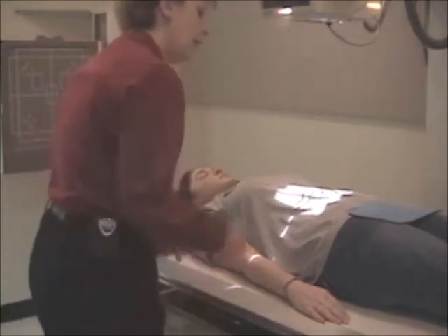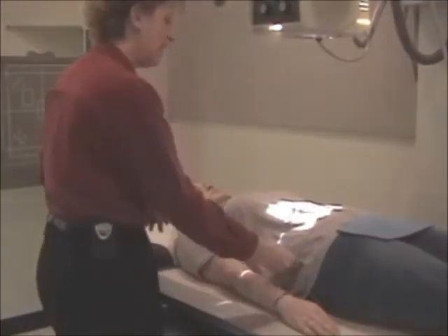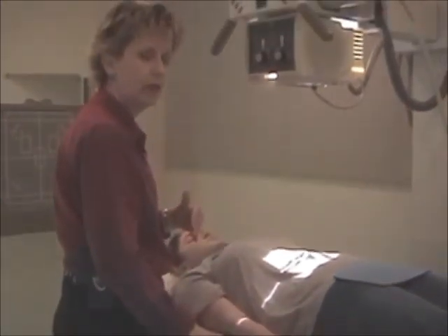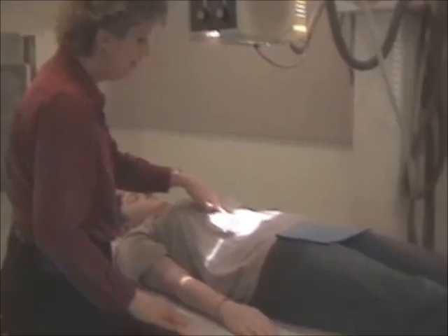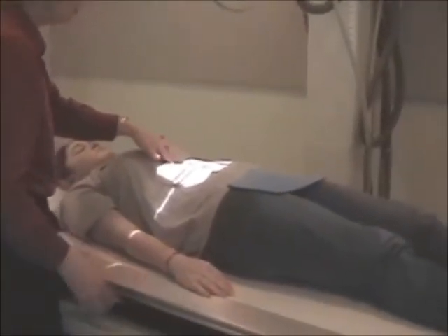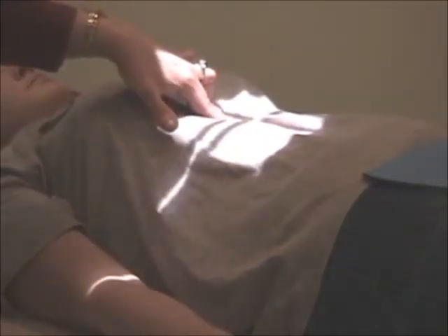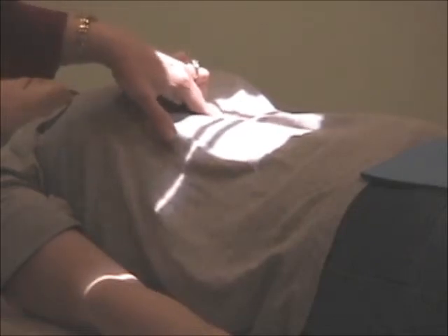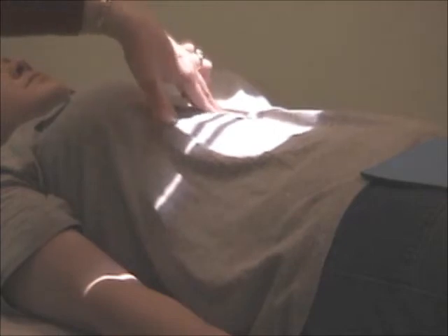Okay. And now the reference part for a sthenic patient. Again, the stomach is fairly midline, slightly to the left side. I'm going to use her xiphoid process, and I'm going to be 1 inch inferior to that, 1 inch below, and I'm going to be 1 inch to the left because the stomach is slightly off to the left side. I'm going to look over my patient and make sure I'm not x-raying tabletop. And I'm not x-raying tabletop, so I'm happy with that position.